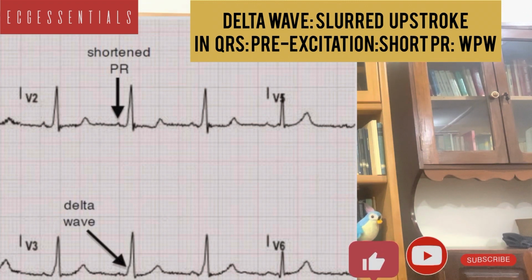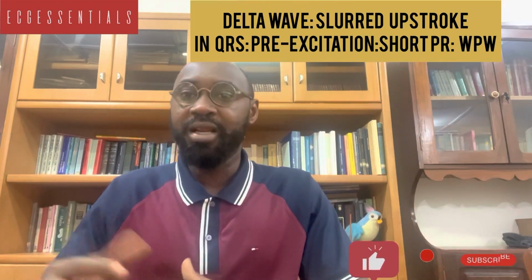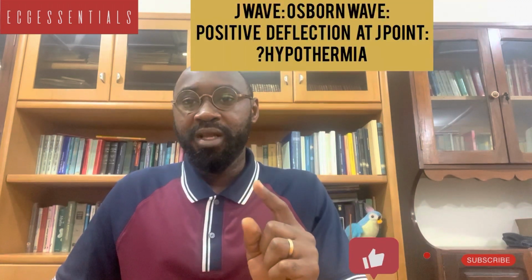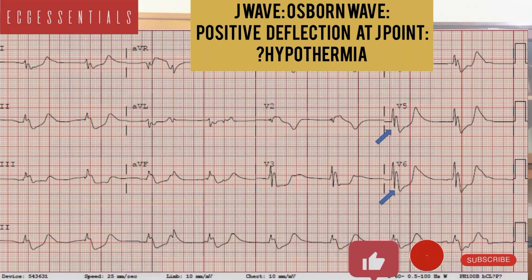So when we find delta waves and short PR intervals, then we should be thinking about a pre-excitation syndrome like Wolff-Parkinson-White.